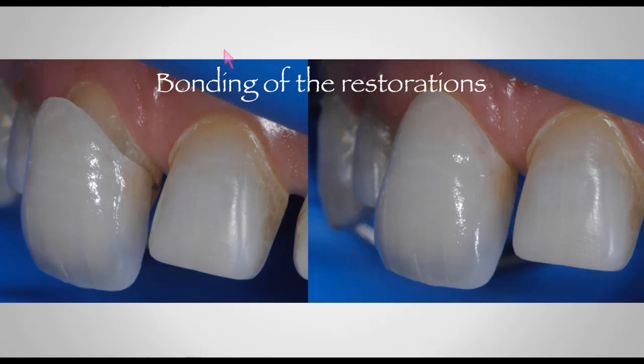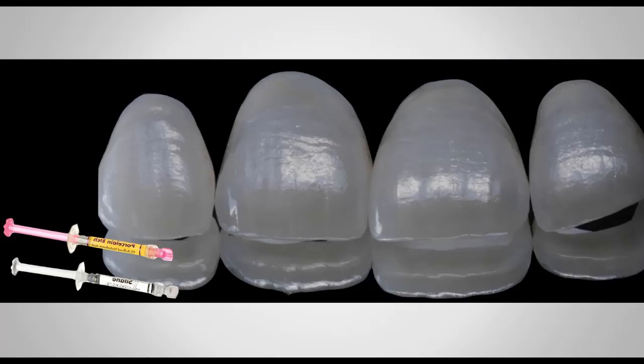And then we're ready. We're ready to now isolate our patient, and first make sure that these restorations fit in perfectly. And that's what you're seeing right here. I'm seating the restoration onto my preparations. You can see the margin is visible, and there is one of the porcelain veneers seated. Very nice fit. I'm ready to try in all the rest of the veneers.